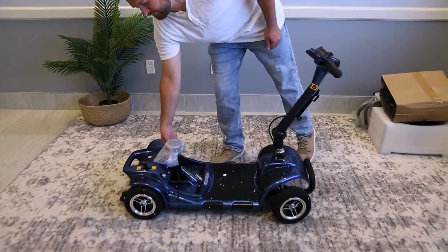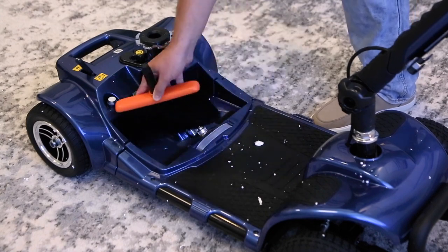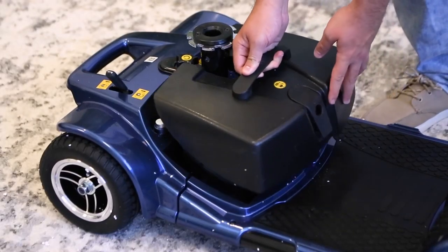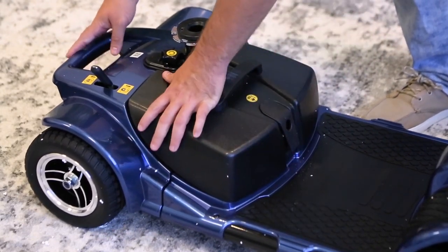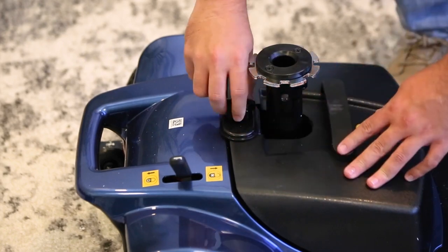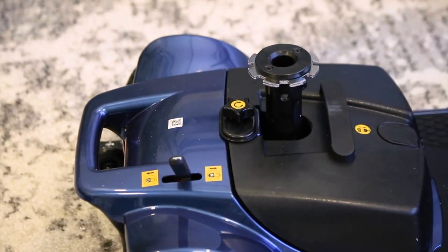Remove any bubble wrap on the scooter and brush out any packing materials in the battery compartment. Clean it out as best as you can to ensure the battery will connect properly. Now grab the battery and fit it in its compartment. Check that the top of the battery is flush as possible with the scooter body. See that metal flap? Move it so it's over both sides of the battery and tighten the screw. This secures the battery in a tight position to avoid it jiggling out of place during your travels.